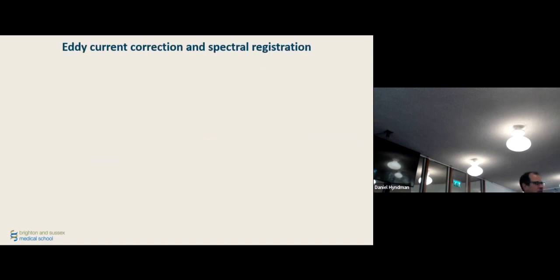So first with the processing, and I promise that every term that is cryptic will hopefully become clearer as we talk. One of the things that corrupts spectra is the main thing that makes the localization happen, which is the application of magnetic field gradients. We apply magnetic field gradients, we switch them on and off within the realm of an existing static magnetic field.